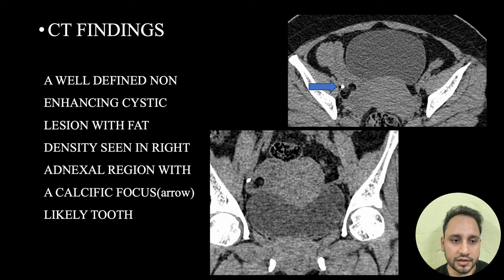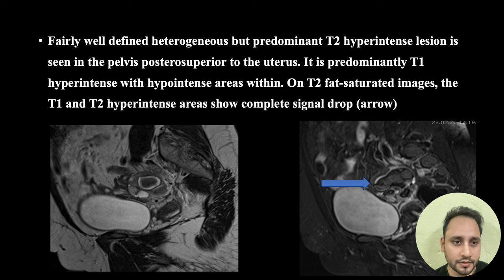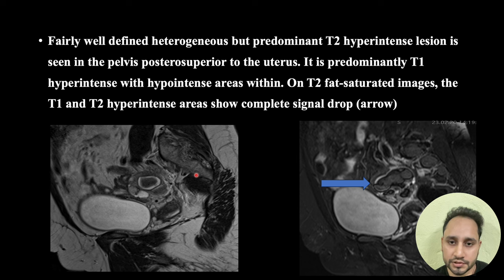CT findings: a well-defined non-enhancing cystic lesion with fat density was seen in the right adnexal region with a calcific focus likely representing a tooth. On MRI, a fairly well-defined heterogeneous but predominantly T2 hyperintense lesion is seen in the pelvis, posterior-superior to the uterus. It is predominantly T1 hyperintense with hypointense areas within. On T2 fat-saturated images, the T1 and T2 hyperintense areas show complete signal drop.